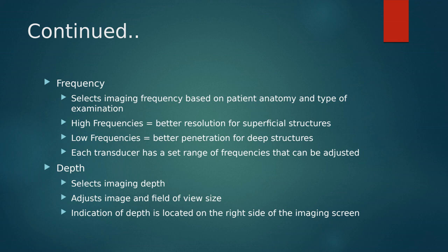If our patient is larger, of course, we need to see deeper into the body. So we need to increase our depth. When you're increasing your depth, you are seeing further into the body. When you decrease your depth, you are seeing more shallowly into the body, okay? So it's going to adjust our image and our field of view size.